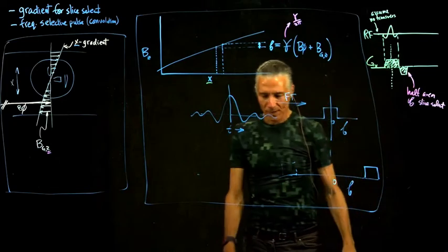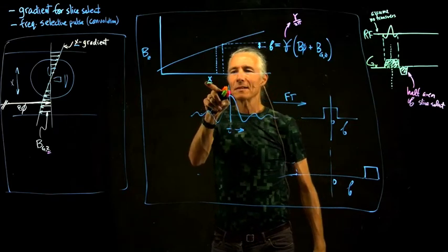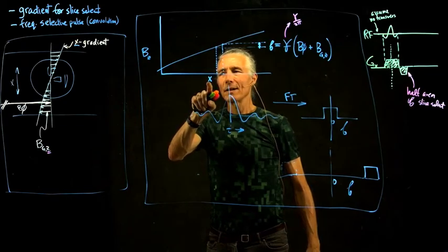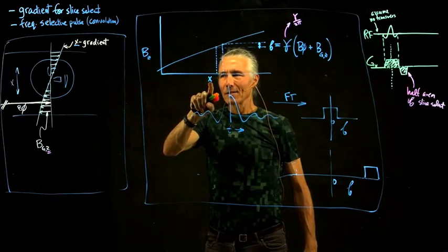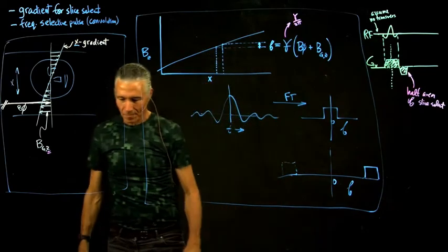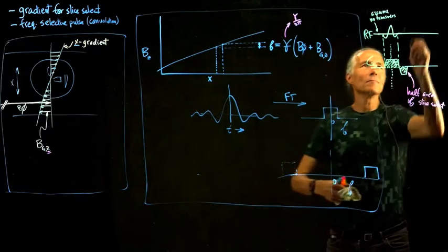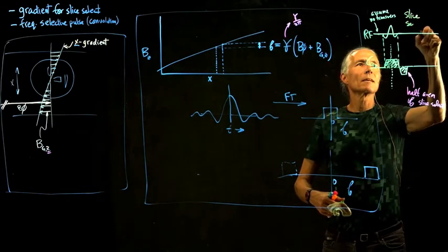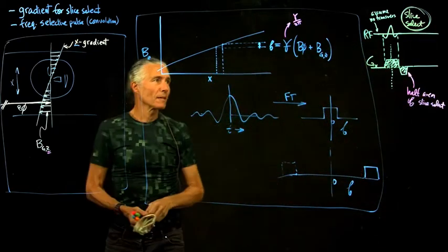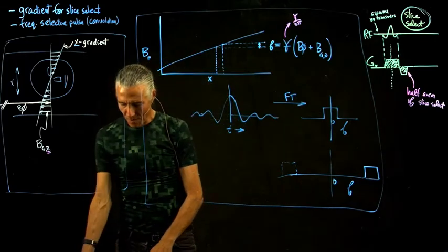Or they call those transverse slices a lot of times. This is we're selecting a sagittal slice. I put this up just so you definitely get the idea that you're not messing with the X, the X gradient is messing with the BZ. Okay, so that's our basic. So let's label this. So this is a slice select. So that's basically slice select gradient.